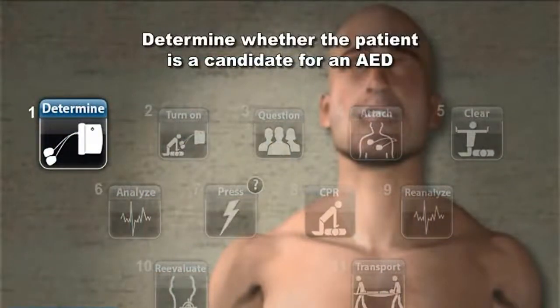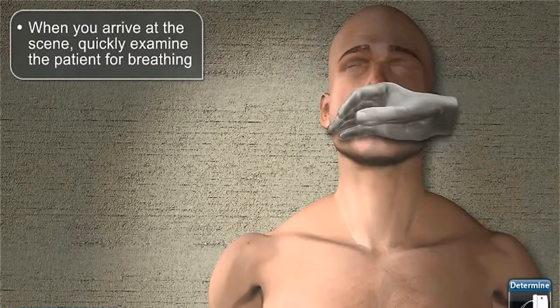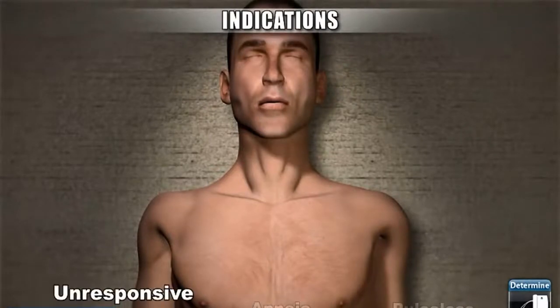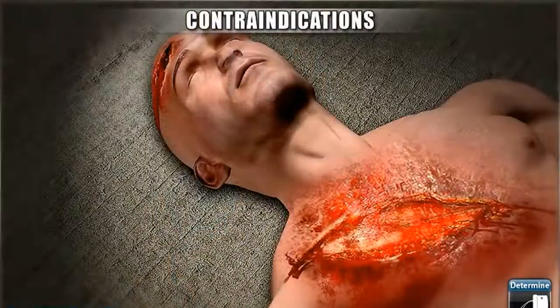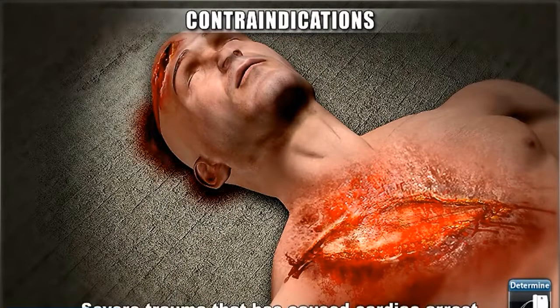Determine whether the patient is a candidate for an AED. When you arrive at the scene, quickly examine the patient for breathing and determine whether the patient is a candidate for an AED. Use of an AED is indicated if the patient is unresponsive, apneic, and pulseless. Use of an AED is contraindicated if the patient sustained severe trauma that caused cardiac arrest.